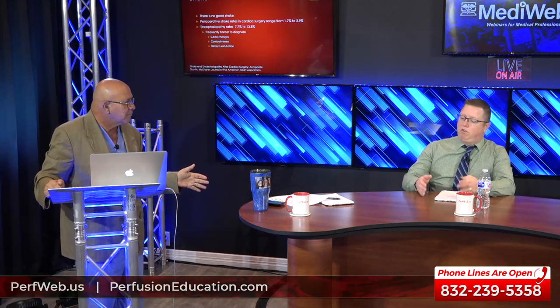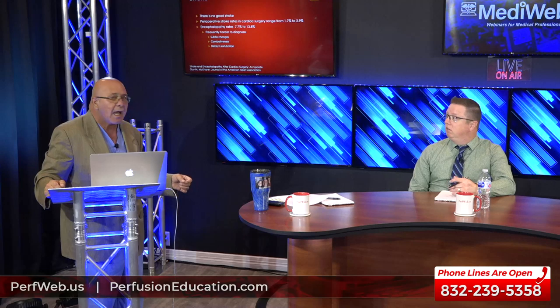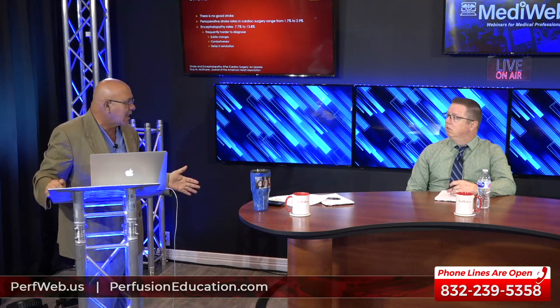So you're saying use it as a trending device versus an absolute device? Absolutely. I don't think you can get an absolute number. No one can convince me it's an absolute number because it isn't an absolute number. But if you're going to use it, then use it.